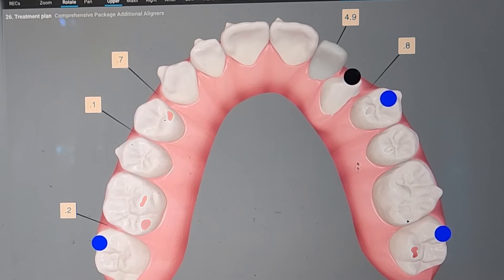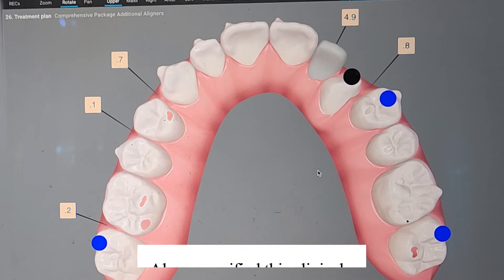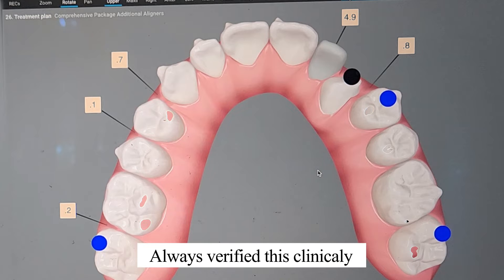I want to see it matching. So if this is what it said, this is what I expect. Now this is not unusual for a refinement — this is a refinement. But for a new patient, this would be unusual unless they had some existing retainer. If so, I might have them stop wearing the retainer for a little while and let the bite settle before starting, because this is going to be a lot more complicated. So always, always verify this clinically. Easy step to make things more predictable.